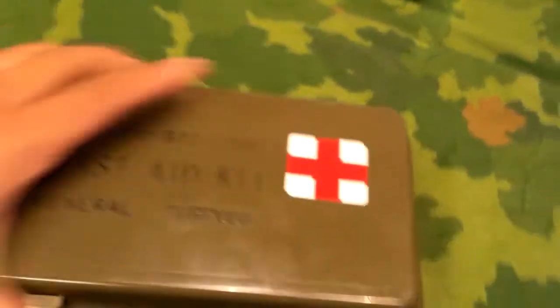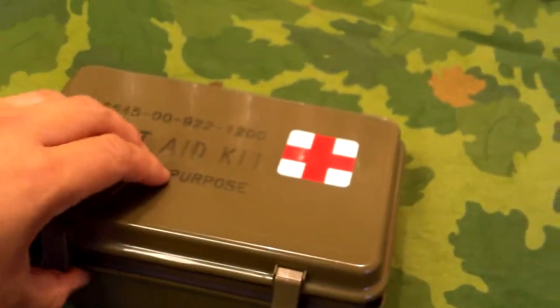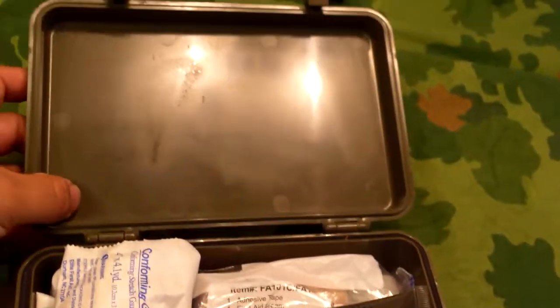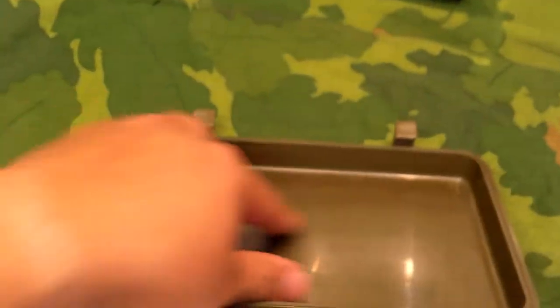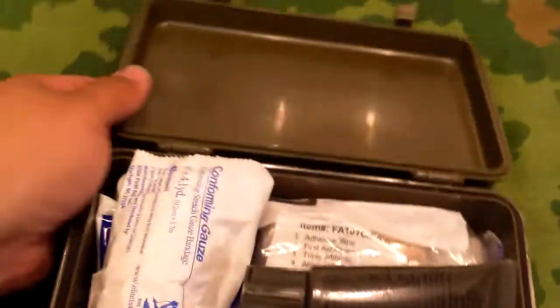This thing expired March 2016 and was made February 2014. I've had it since it was brand new — it had plastic around it and did have a content sheet. Normally the content sheet on USGI ones is right here, but it doesn't look like it ever had one. Here are the contents, so let's start pulling things out.